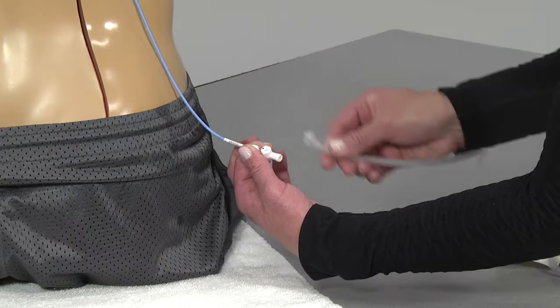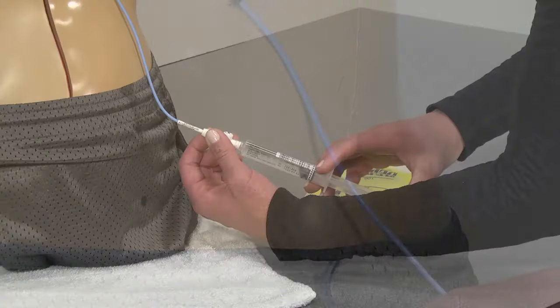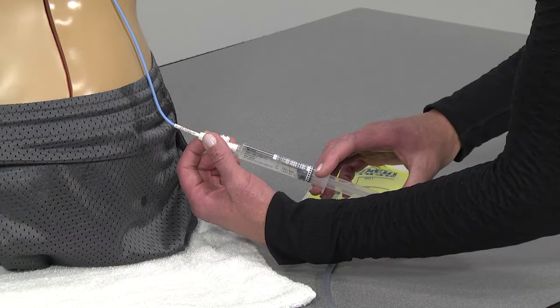If you have any of these signs or symptoms, follow these steps. If the tube is capped, uncap it and attach it to a drainage bag. Be sure the drainage bag is below the level of the tube site. If your tube is already attached to a drainage bag, remove your dressing and check to see if the tube is twisted. If the tube is twisted, straighten it until the fluid begins to flow. If fluid does not drain after removing the twist in the tube, you may need to gently flush the tube. If these steps do not relieve the signs and symptoms, call your doctor or go to the nearest emergency department.